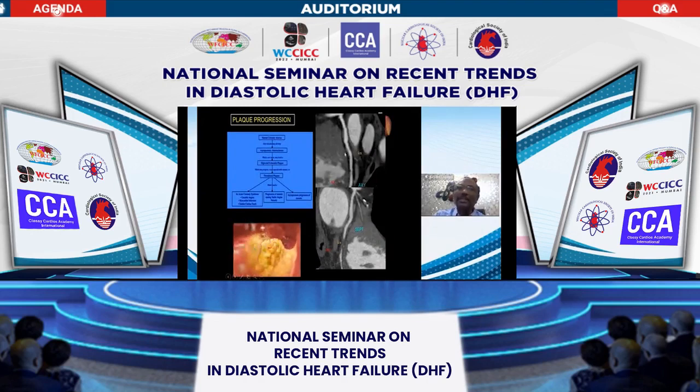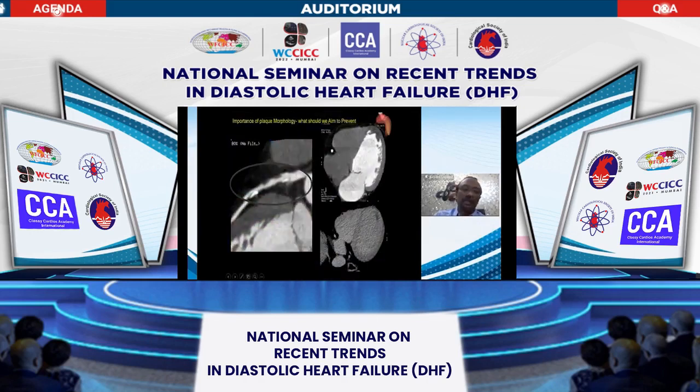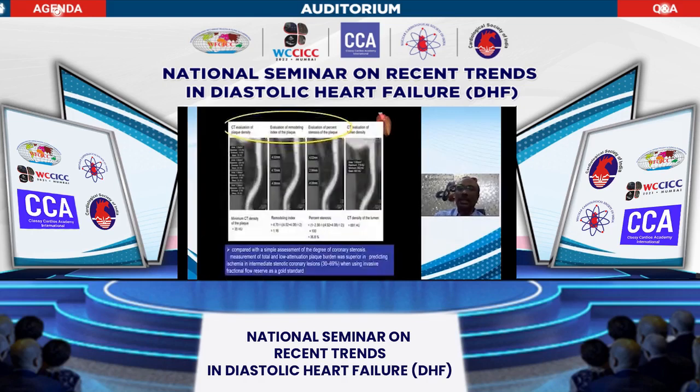In July, this patient came to us with non-specific chest pain, with an ectatic vessel with a long segment of vulnerable plaques. In September, he presented again with typical chest pain with raised troponin levels. He wanted to undergo a CT angio again, and we see the plaque rupture with the stenosis which has happened in the same patient. So this patient taught us the concept of the vulnerable vessel, the asymptomatic atherosclerotic cascade, which ends in an acute MI. Again, another example, a ruptured plaque with an anterior wall MI. Unfortunately, this patient landed to us with an apical clot and a thrombus.